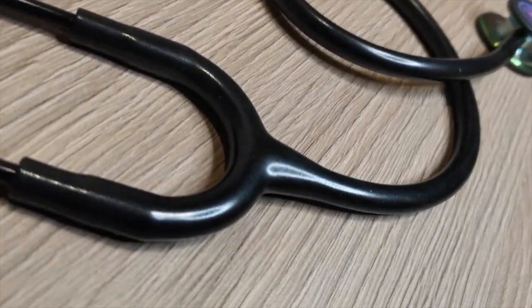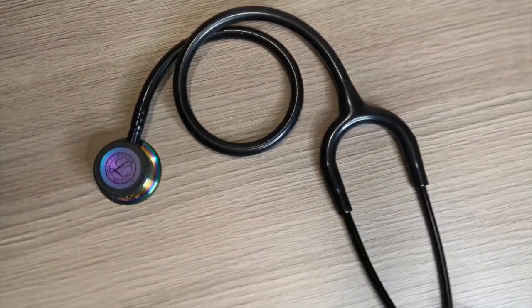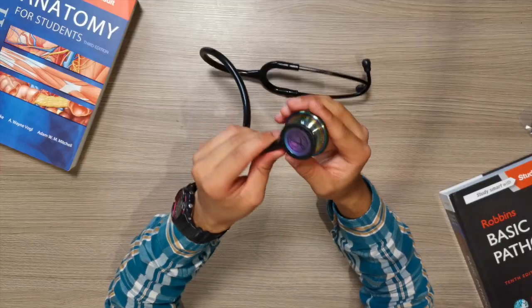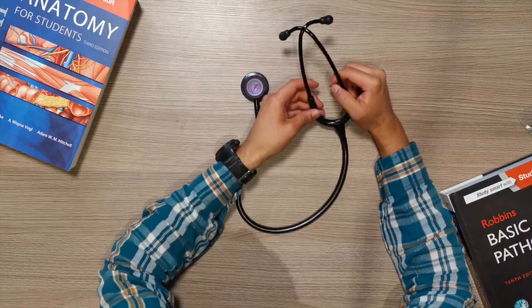I got the Lipman Classic 3 stethoscope in the black and rainbow finish. As you can see, the black and rainbow finish refers to the chest piece — it's got this really cool finish on the diaphragm that sort of stands out from all the black that is here. It's fully blacked out otherwise.